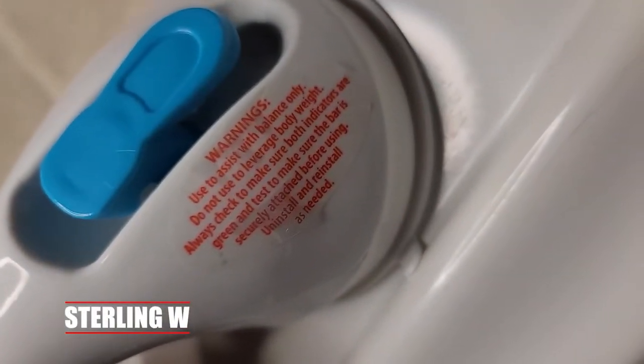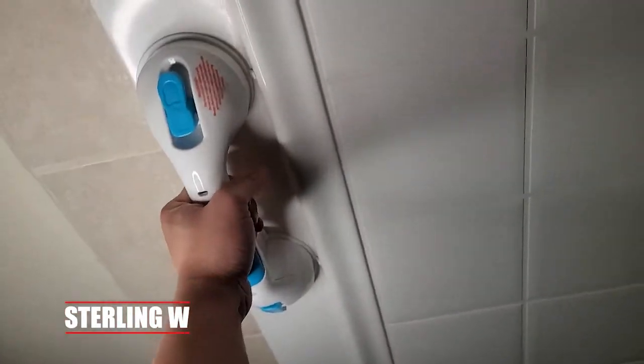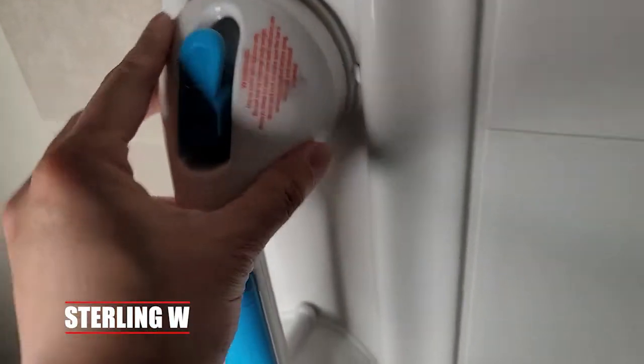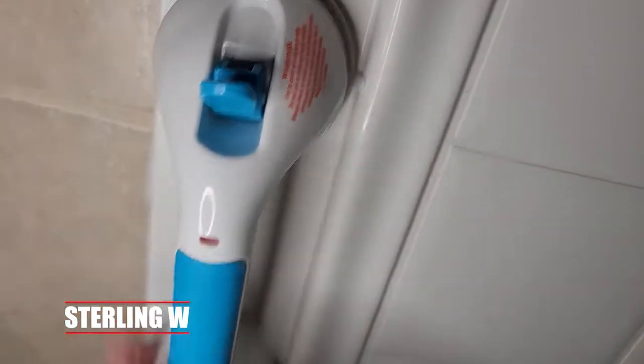Of course, it has that warning label saying that this is only a grip and not to put your full body weight on this thing — so it's more for a grip than anything else. Without having to put holes in the wall or anything like that, it's actually very convenient to use suction cups like this, because there's no tools needed.